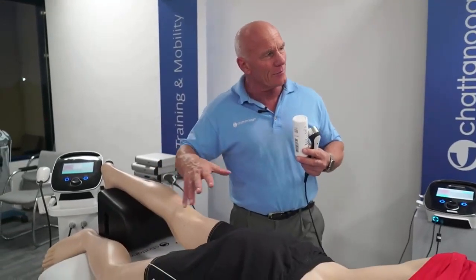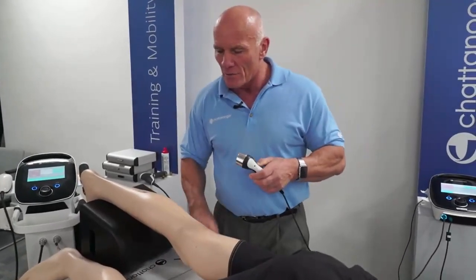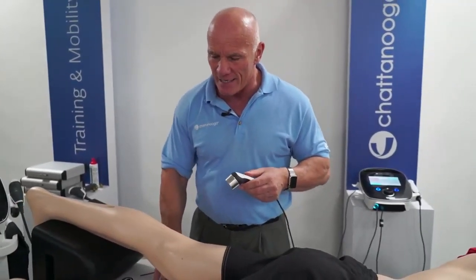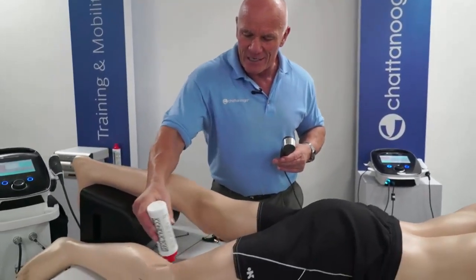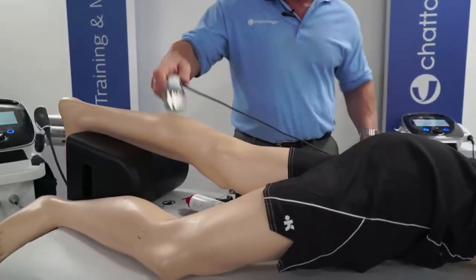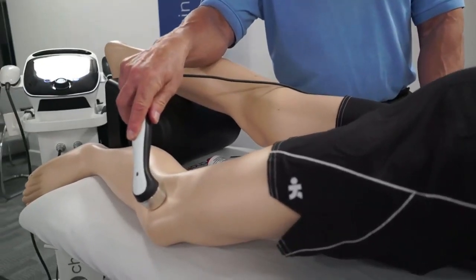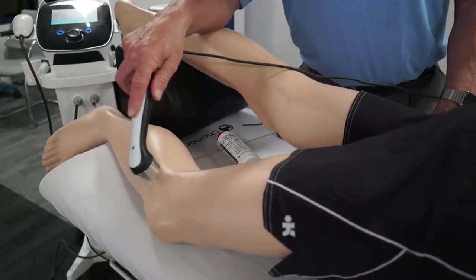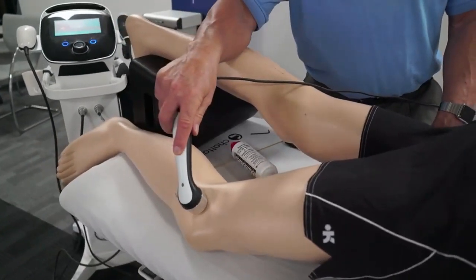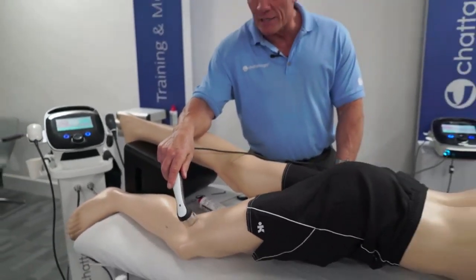Okay, so the area to be treated then, we will cover for Fred in our ultrasound gel. Okay, and we're going to work the whole knee, so the anterior. Some of the studies were slightly different. The one that I've chosen the treatment protocol for, they were doing the anterior, posterior, medial and lateral, so they used a longer treatment time. Okay, across the patella? They avoided the patella in that study, but anterior, posterior, medial.